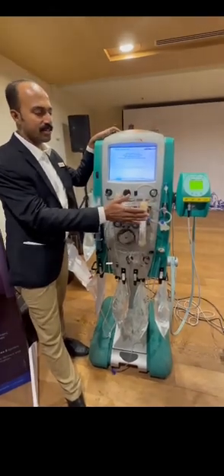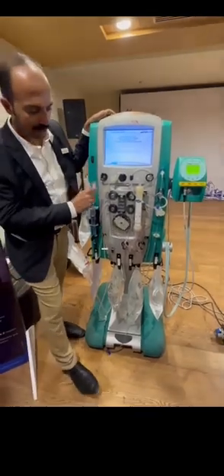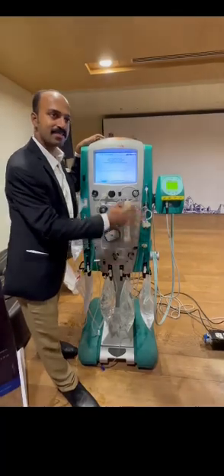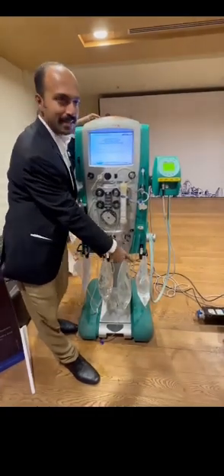How many bags are there for one day of therapy? For the filter, that will be 10 bags. Next day onwards, we need 10 bags; the filter is not required, it depends. The first day, around 50,000 is the consumable cost. Second day onwards, it is 30,000.